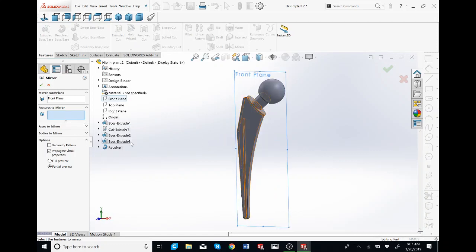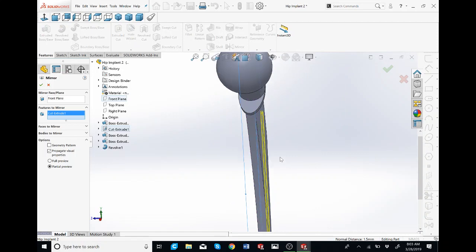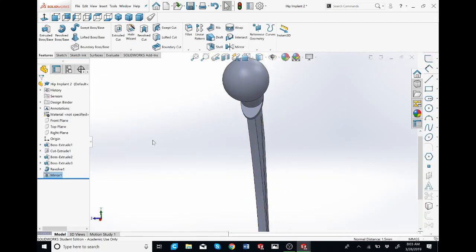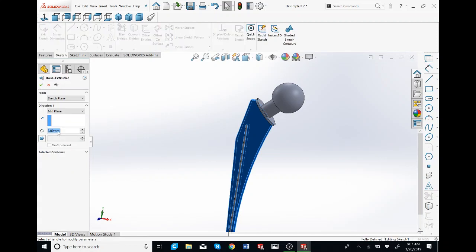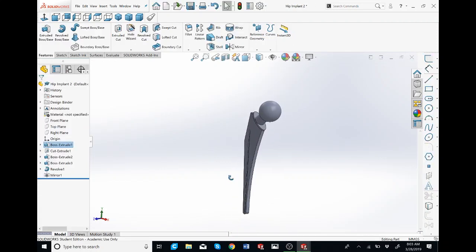So features to mirror, I'm just going to zoom in, just click on this, or you can just click on the cut extrude here. You see that it's highlighted, showing the preview of what it would be. I'm just going to check, and that's it. If you find out that in previous steps you didn't actually make it mid-plane, you can just right click here, edit feature, and then make it mid-plane over here. I'm just going to Control S to save it real quick.